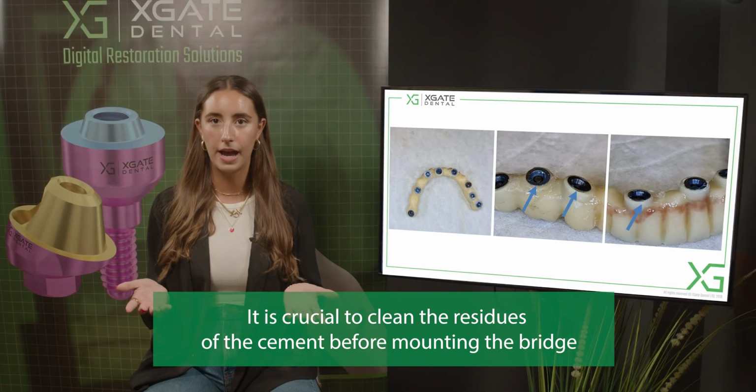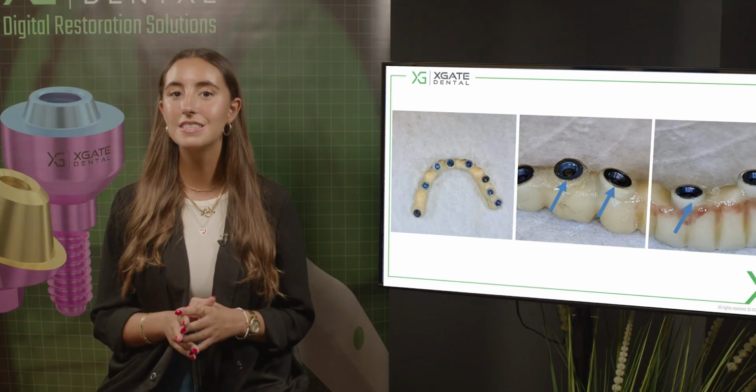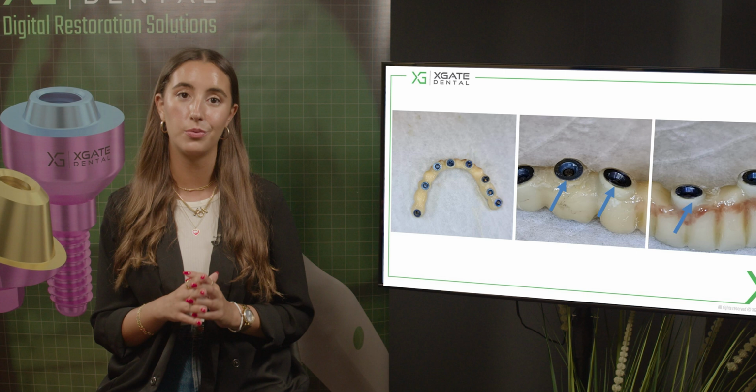So why did it happen? This deviation came from when we did the impression. The technician placed the scan markers on the impression that we took.